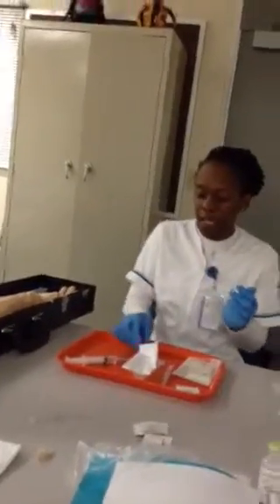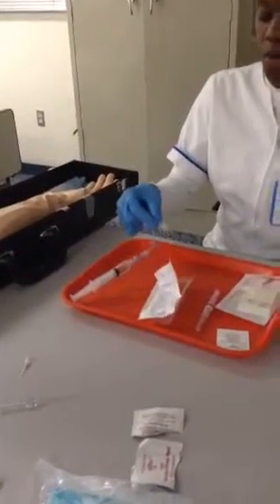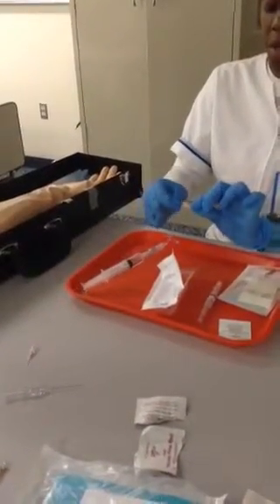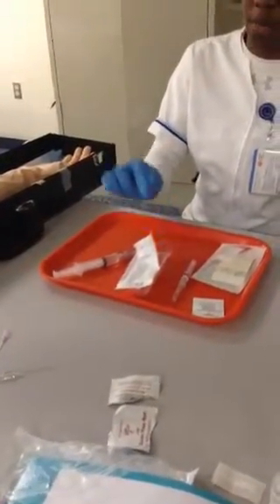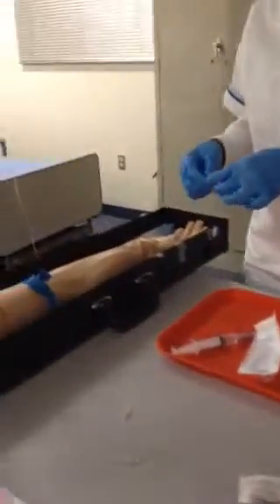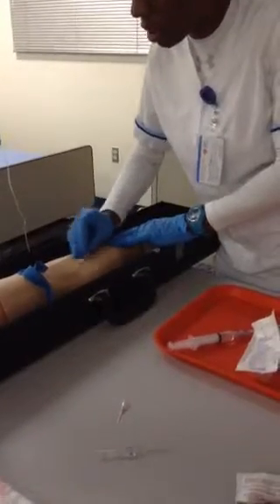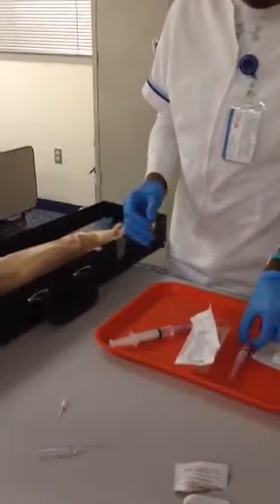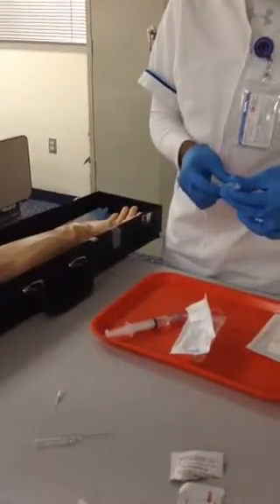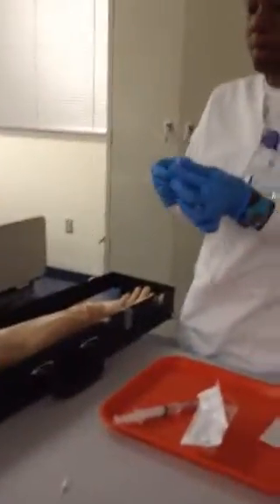Grabbing my clamp, I'm going to remove the tubing from the sterile field, removing my cap without interfering. I'm going to take my alcohol wipe and wipe in a circular motion, inner to outer. I'll dispose of that. I'm going to take my 20-gauge needle, bevel up.